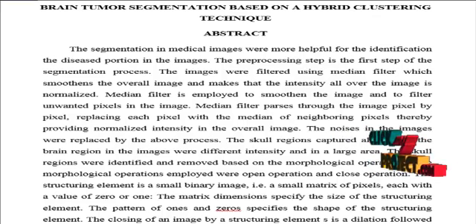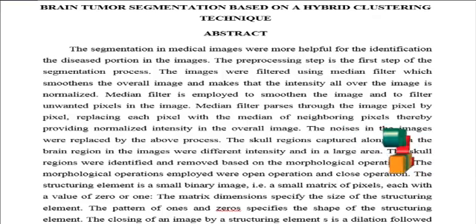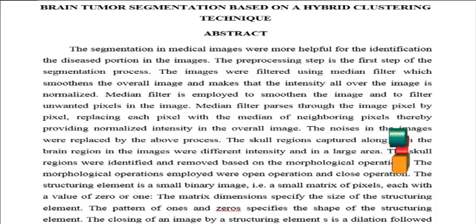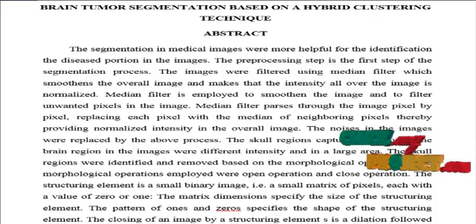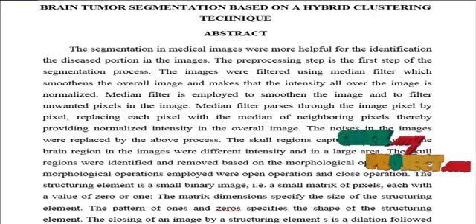In fuzzy clustering, every point has a degree of belonging to clusters, as in fuzzy logic, rather than belonging completely to just one cluster. Thus, points on the edge of a cluster may be in the cluster to a lesser degree than points in the center of the cluster. An overview and a comparison of different fuzzy clustering algorithms is done. Any point in the image has a set of coefficients giving the degree of being in the cluster. With fuzzy C means, the centroid of the cluster is the mean of all points weighted by their degree of belonging to the cluster.